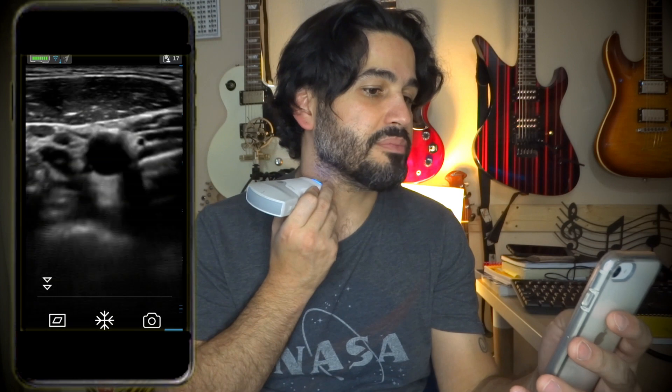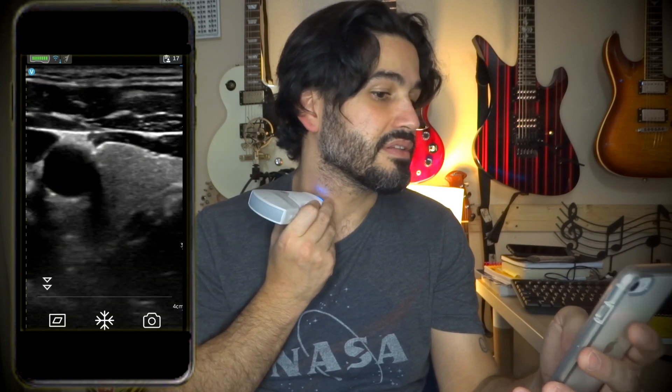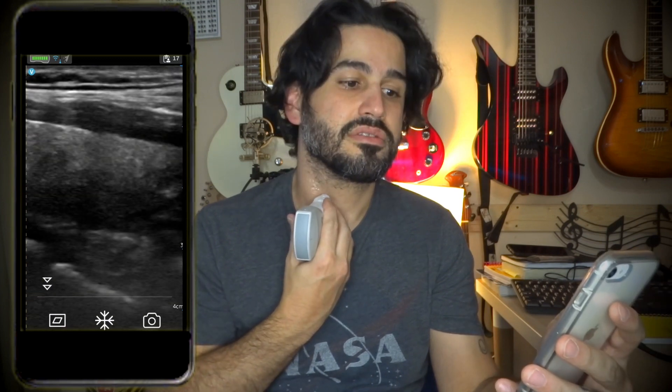If I scroll up with my thumb from down to up I can get more depth — I don't really need that much — and if I scroll down I get less depth, which is about right. If I swipe my thumb side to side I can increase the gain. There's the thyroid and carotid.